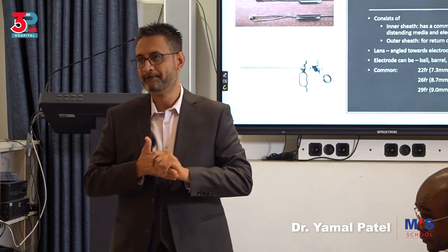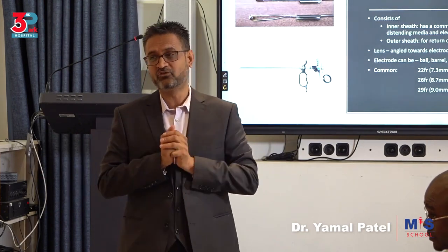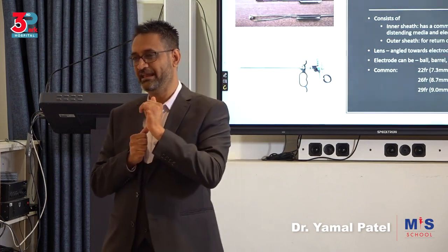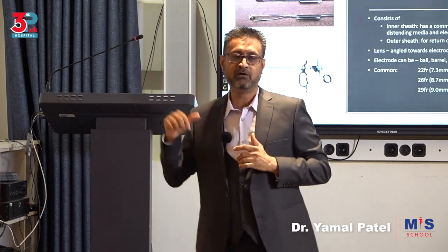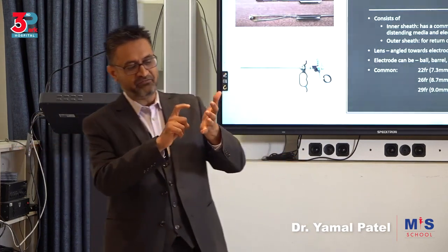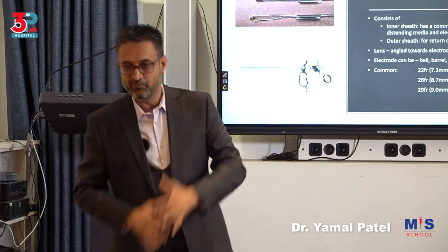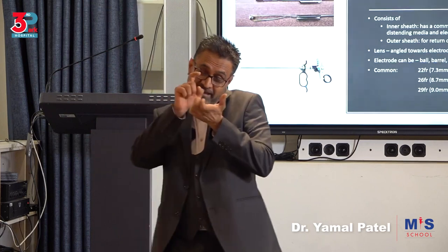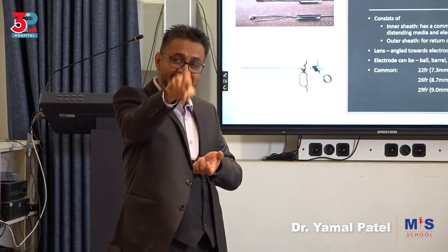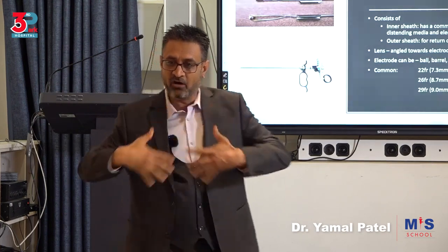It's okay. Yes, it will burn. That's the most common answer that people give. It's wrong. That's why I'm trying to explain. What did I just say about the electricity and electrolytes? It disperses it, right? So remember what I said: fine in, burn; broad out, no burn. Now here, you're in with an electrode with a fine tip where you're going to try and burn something on the uterus, but all surrounding it is what? Saline, which has lots and lots of electrolytes.